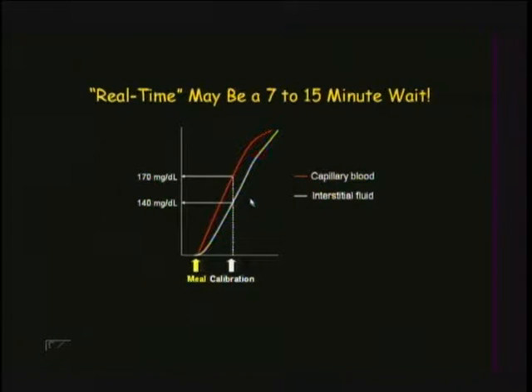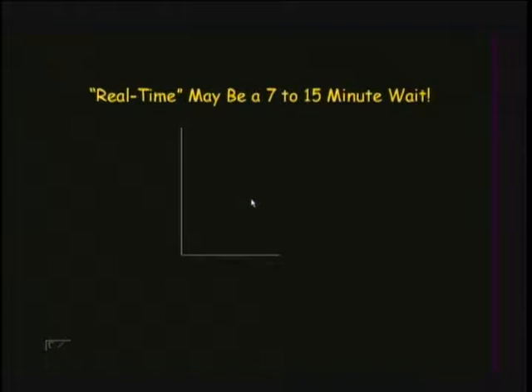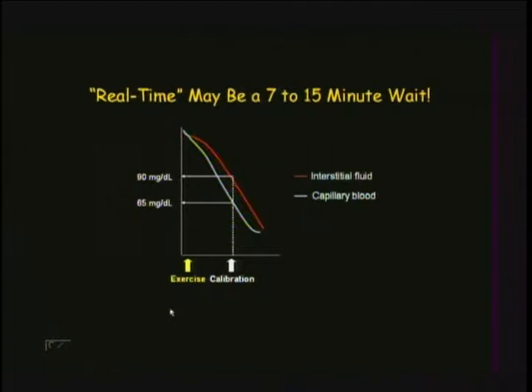Now, patients need to know this, but what they really need to know more is from this slide, which is a slide that I just drew, but I think it is also very accurate, where again, we see a lag between the actual capillary glucose and the interstitial fluid glucose. So in this example, if one exercises down here at time 0, the actual glucose is 65, the interstitial glucose hasn't caught up yet, and the interstitial glucose on the sensor says 90. So if that glucose level is going down, you can rest assured that the actual glucose is actually further down than the interstitial glucose says on the sensor.